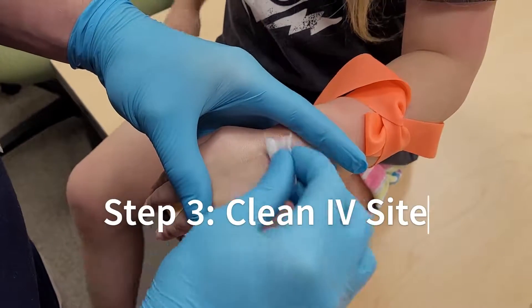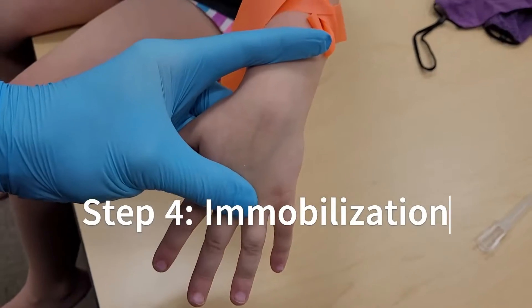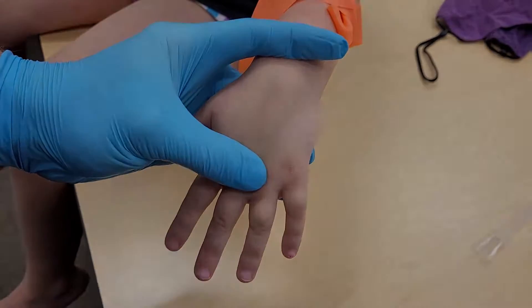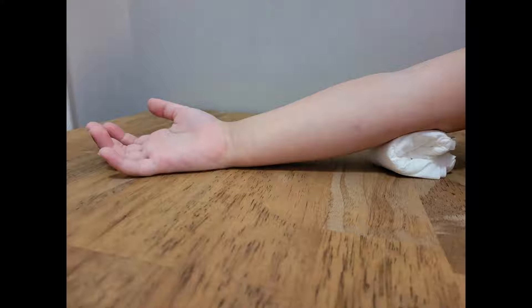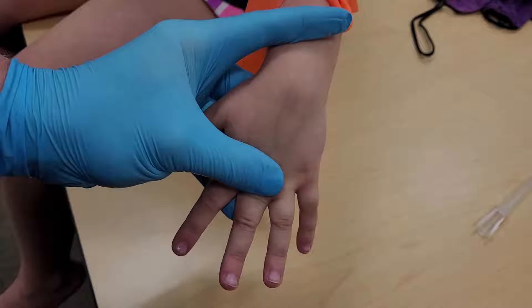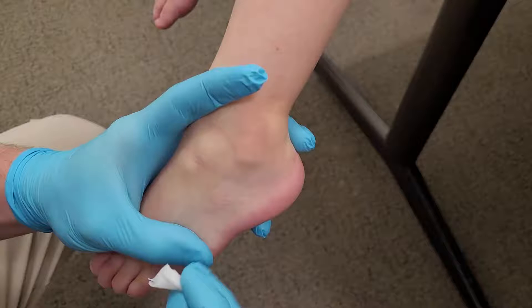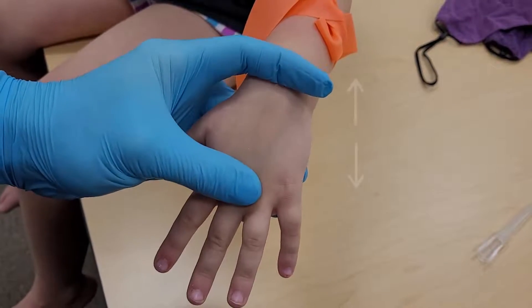Step 3: clean the site. Step 4: immobilize or isolate the chosen IV site and gently put the vein on stretch. This can be done by placing a soft roll of gauze under the elbow to elicit full extension if cannulating an antecubital fossa vein, or by holding the hand firmly with the wrist in flexion if using the dorsal hand veins. If the dorsal foot veins are to be cannulated, hold the foot firmly in plantar flexion. You can then stabilize the vein by placing your thumb and forefinger at either end and gently stretching the vein.